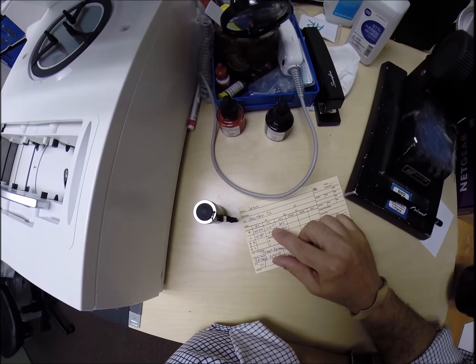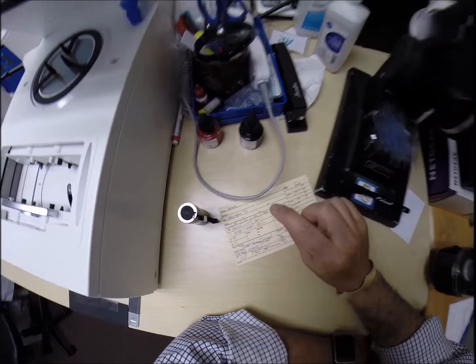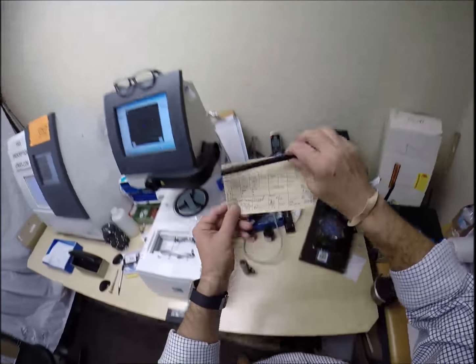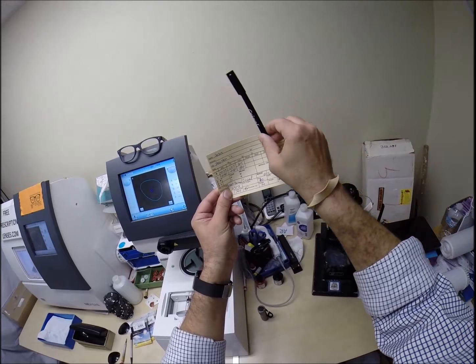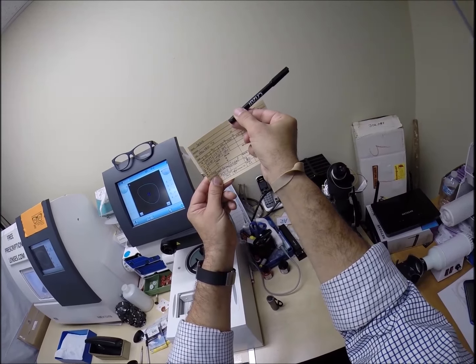Uncorrected astigmatism makes 6s and 8s look alike, or the letters P and F. So it's like the fine-tune knob, and we just turn that fine-tune knob to 165, 0 over here, 90 in the center, 180 all the way. We're just going to turn that fine-tune knob to 165.